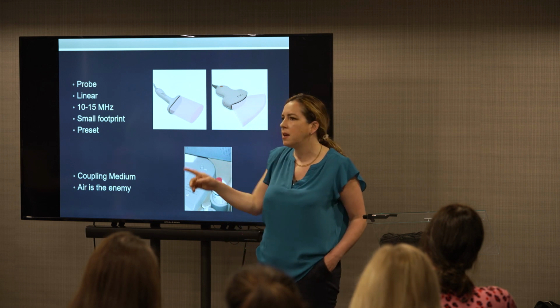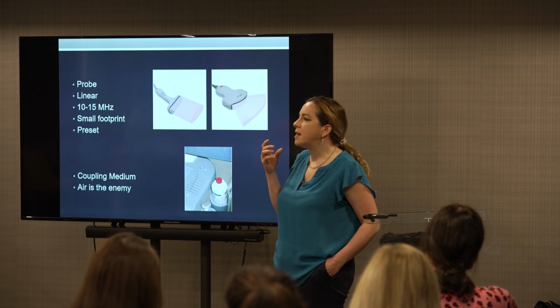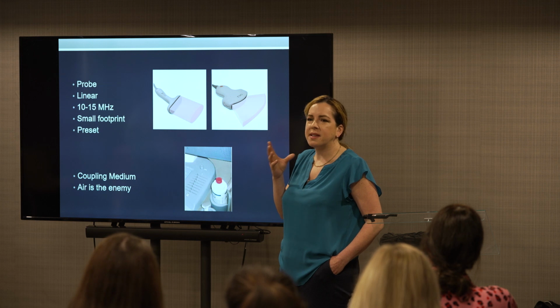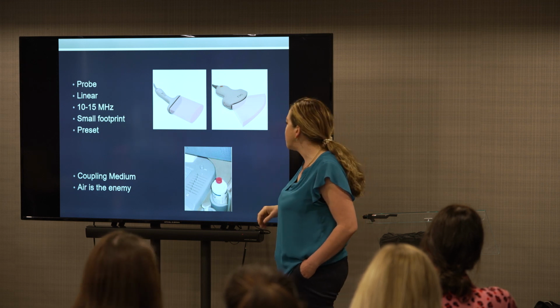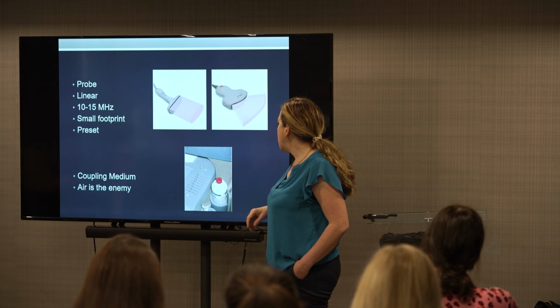I can see jelly round the room like this. Beards, I was thinking on the way here, are also the enemy. So big, fluffy, bushy beards, vain men, hipsters that don't want to shave their beards. It's very tricky. It reflects all the light. You can smother it in gel, but it doesn't quite work, and it's obviously not great for procedures, for sterility.